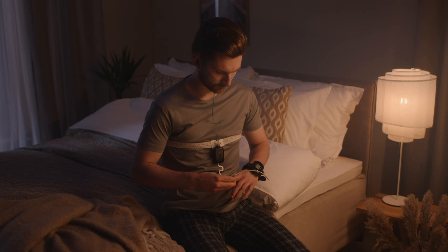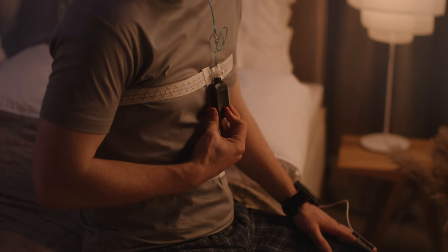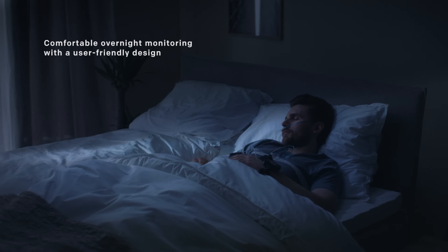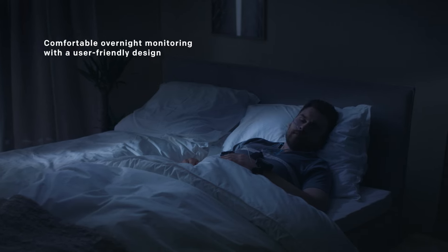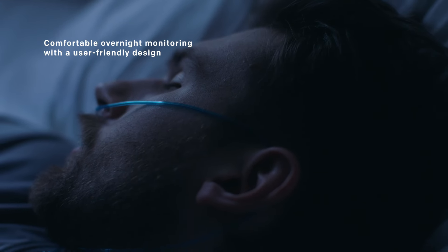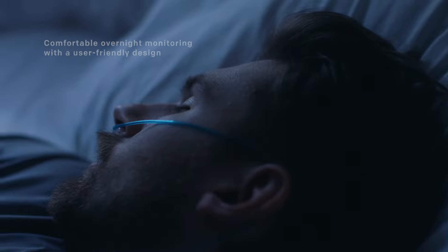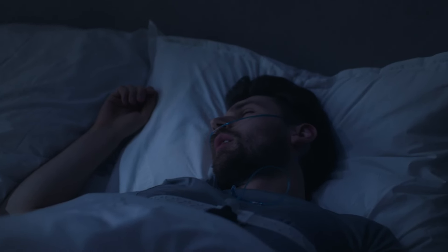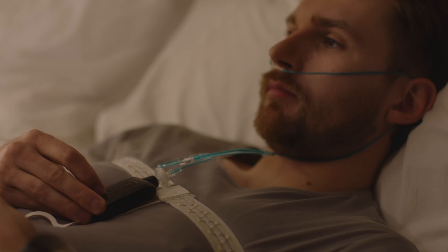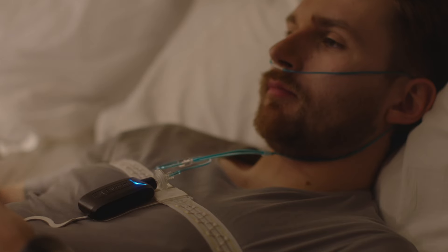The patient wears the device, starts the recording with a single button, and sleeps through the night while the device quietly records the patient's bio-signals. The device's design ensures a comfortable experience throughout the night. After waking up, the patient stops the recording, removes the equipment, and packs it into the carrying case.